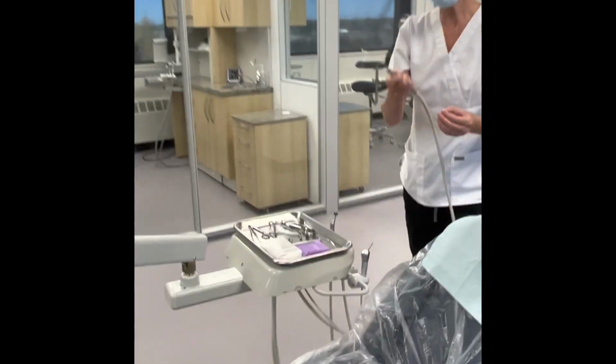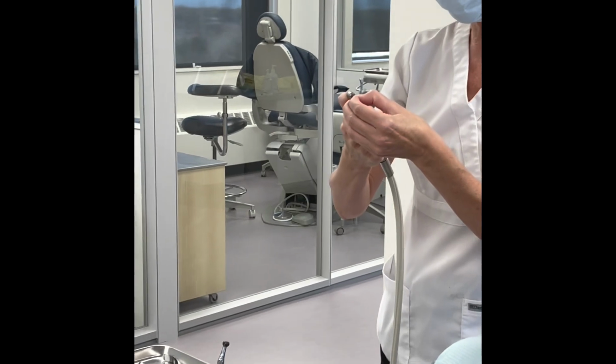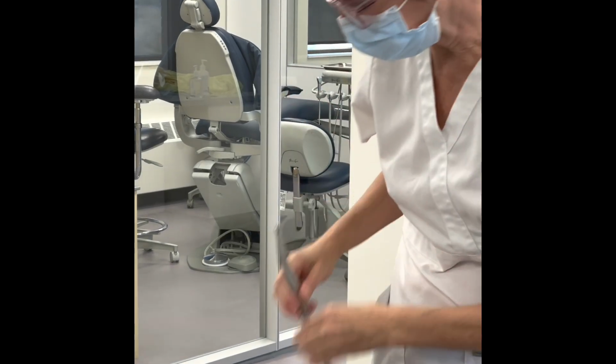So with the high speed, there's just a little button on the back. You're going to press that. As you're pressing it, you're going to put the burr in, and then release the button on the back, okay? Give it a good tug to make sure that's in there correctly.